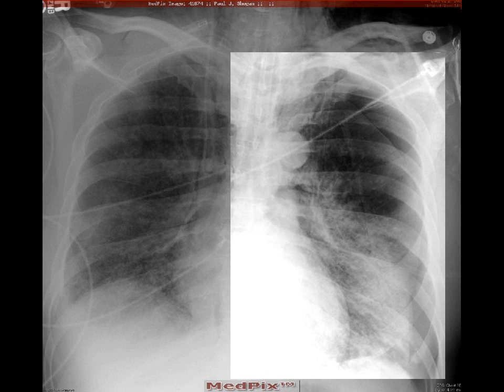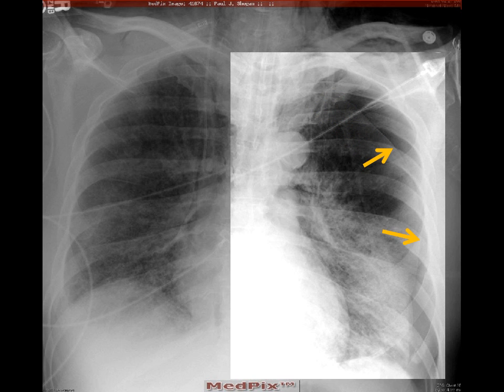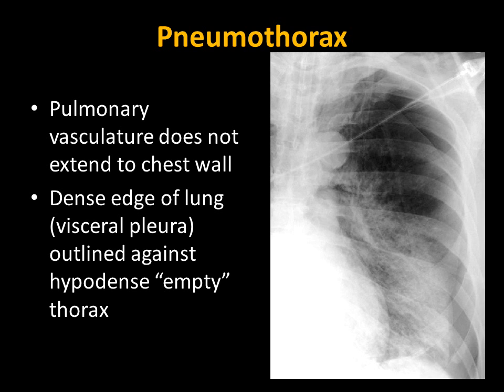Looking at the left lung field with improved brightness on this film, we can see that the vascular structures of the lung do not extend completely to the chest wall. There is a hypodense area in the apical lung field against the slightly more dense lung, producing an edge that continues around and inferiorly along the lung field. This represents a pneumothorax — a complication of ET tube placement representing barotrauma. The pulmonary vasculature is seen not extending all the way to the chest wall, and that edge is produced by the empty thorax against the slightly more dense lung.